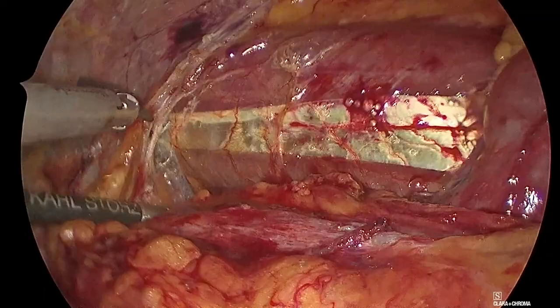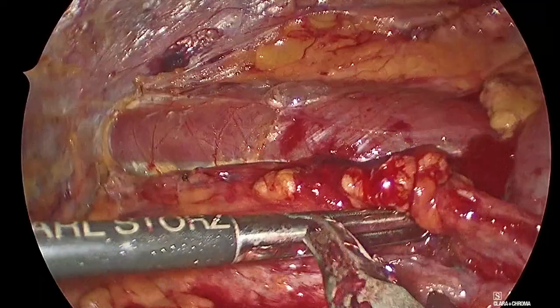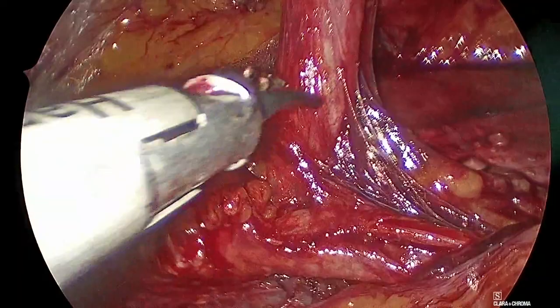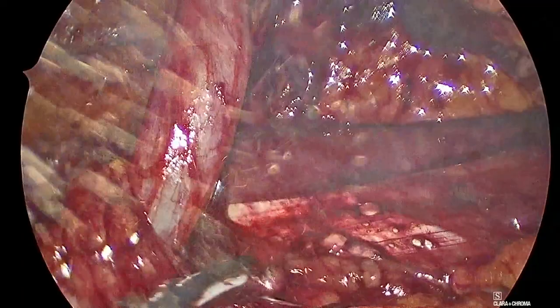And then for kidney transplantation, since I use a technique where I can, oops, there's a little bleeder there. Let's see what it is. Since I use a technique where I can, let me see, just a second, where the assistant can really do part of the anastomosis, then the resident from year number 3 gets to do the vascular anastomosis. They are part, let's say, of the vascular anastomosis, their side.